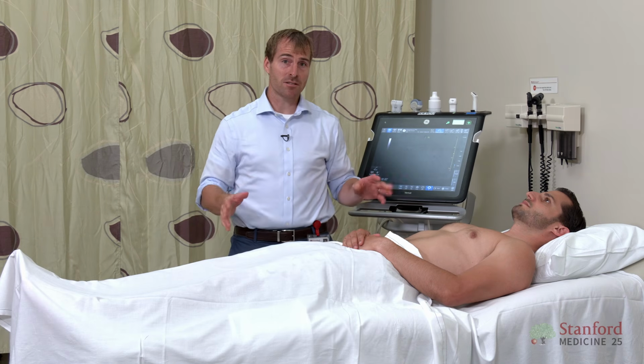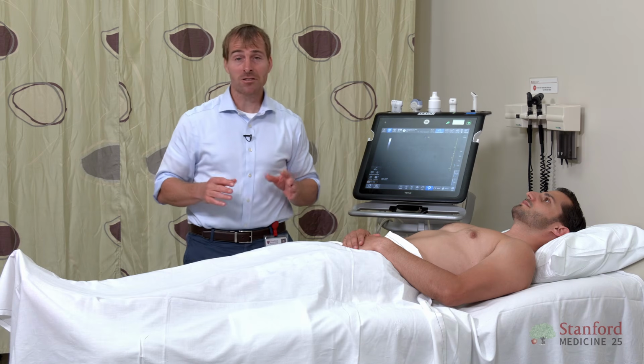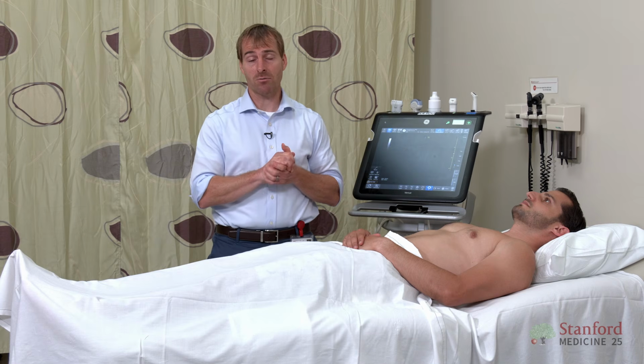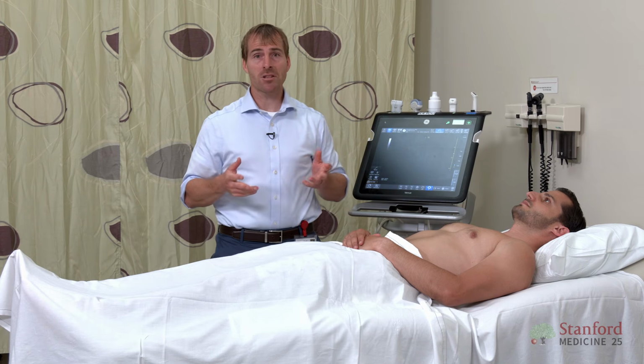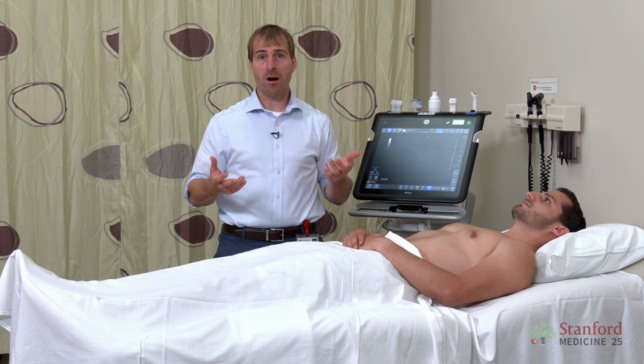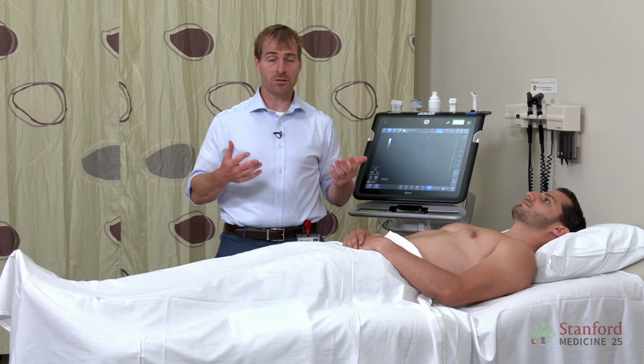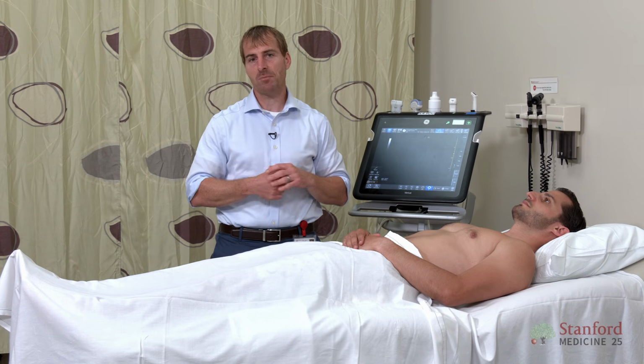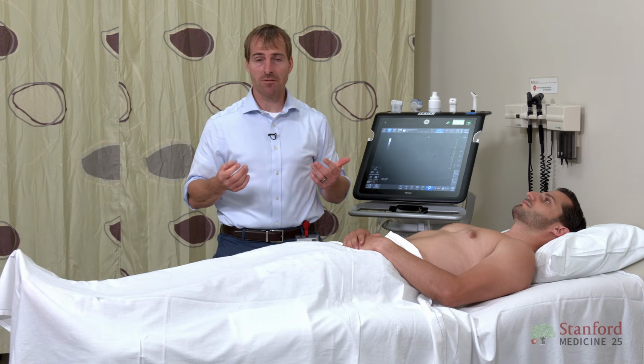Of all of the scans that I do as a hospitalist, this is probably the most common one. And certainly when I look at my trainees, this is far and away the thing that they do the most with point-of-care ultrasound. And it's understandable. A lot of our patients have problems with fluid, whether they have too much or too little. So it's a frequent question that we're trying to answer, which is, what is this patient's central venous pressure? And the IVC has really helped us to get a better understanding of that.